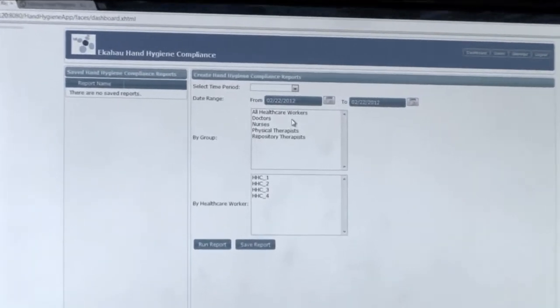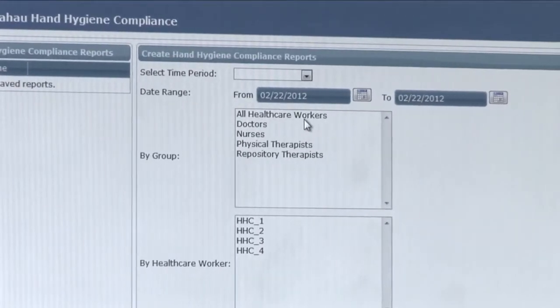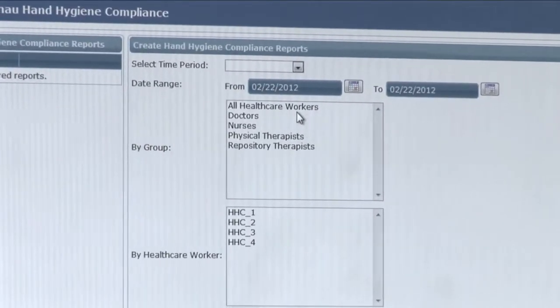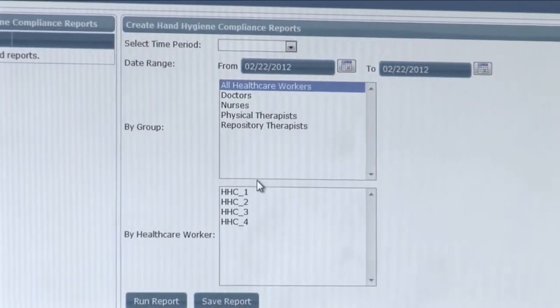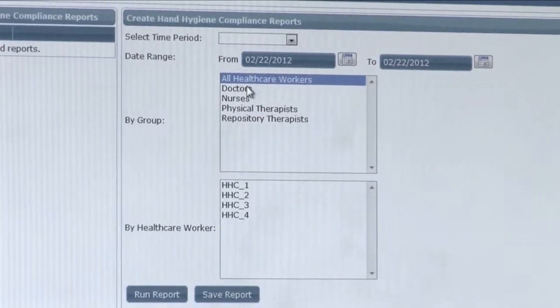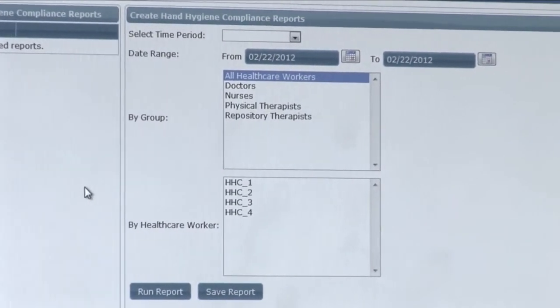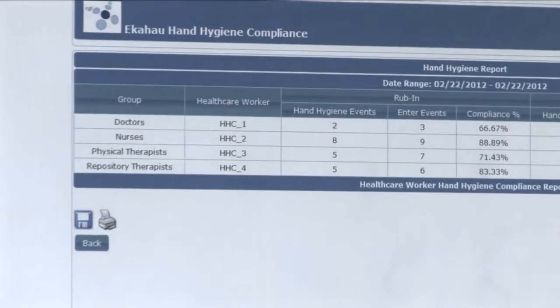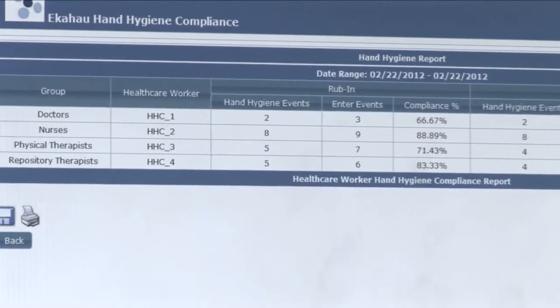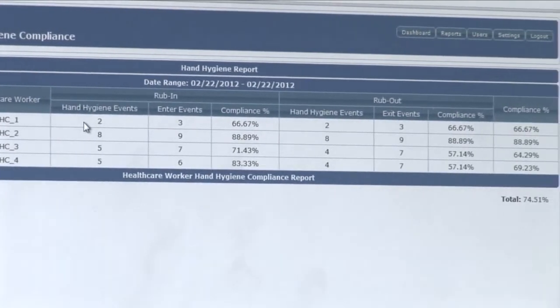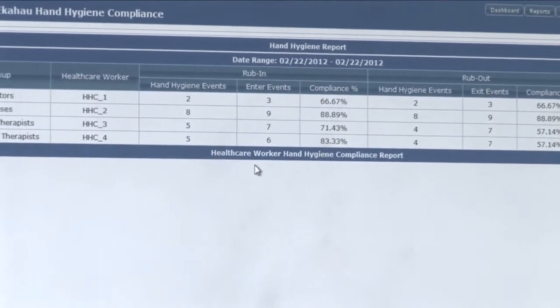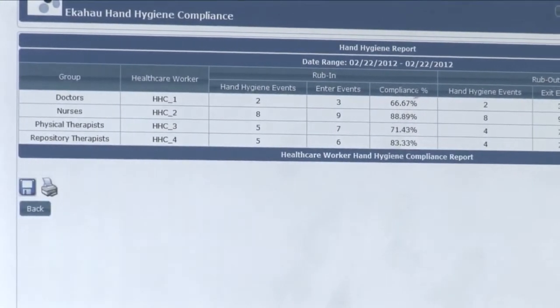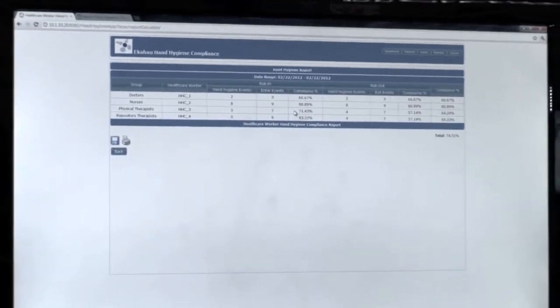In this we can select all the healthcare workers within the facility, or a group, or multiple groups. When you select a group we can do it by a specific day, and all we need to do is select either the group or the actual individuals. When we run the report, the system goes through the database taking all the hand hygiene events and how many enter events that healthcare worker performed, and displays their compliance for their rub-in performance.